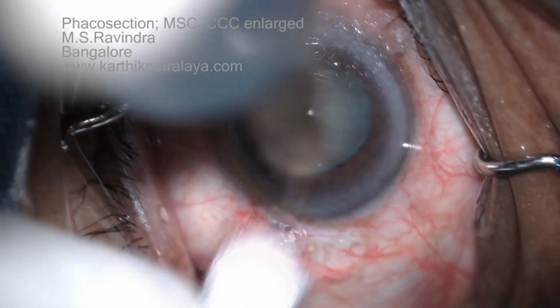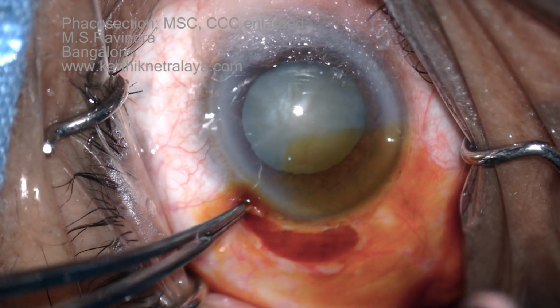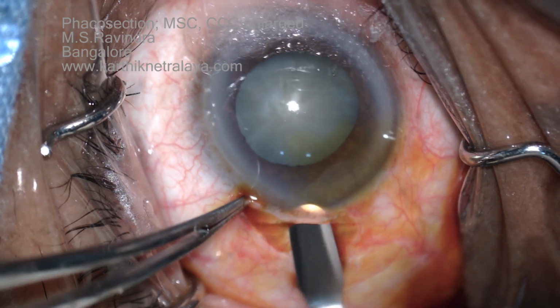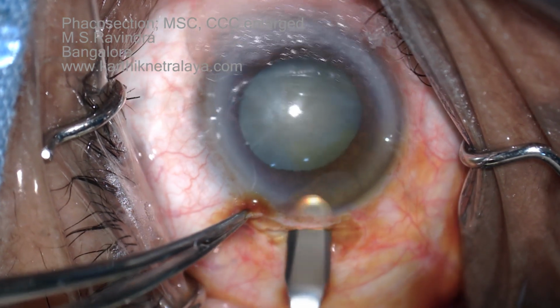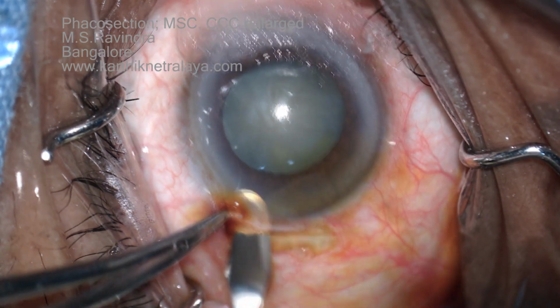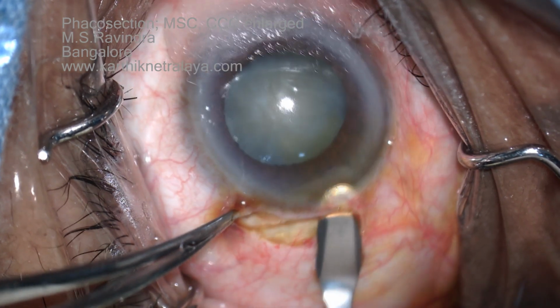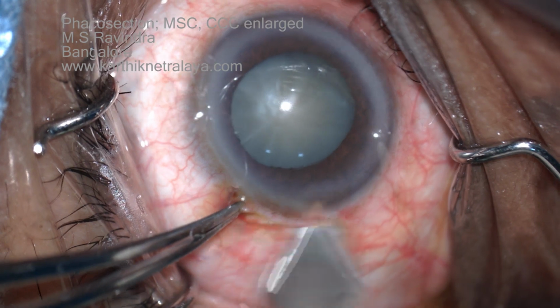We're trying to dilate the pupil a little more with tropicamide phenylephrine eye drops, applied on a piece of cotton at the opposite limbus. A sclerocorneal tunnel is created and the anterior chamber is not entered at this stage. The sclera is fixated with good scleral fixating 1 to 2 forceps.